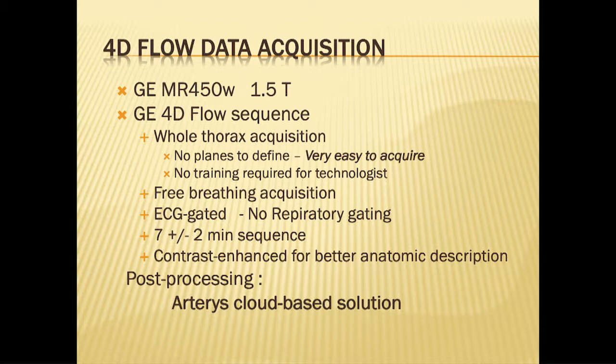We still use contrast enhancement, but in practice, less and less. We are not at the point to make non-contrast acquisition, but we improve our techniques to work without contrast. But if we want to ensure the anatomy, we use contrast.